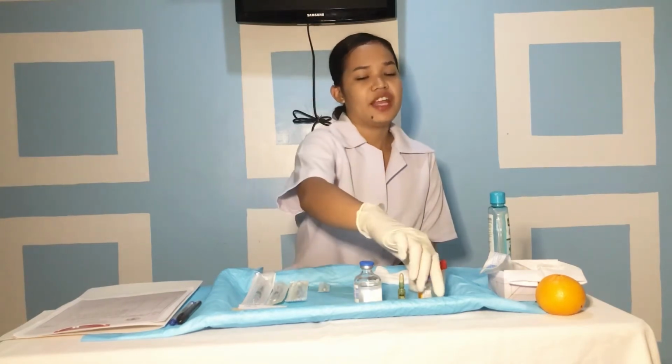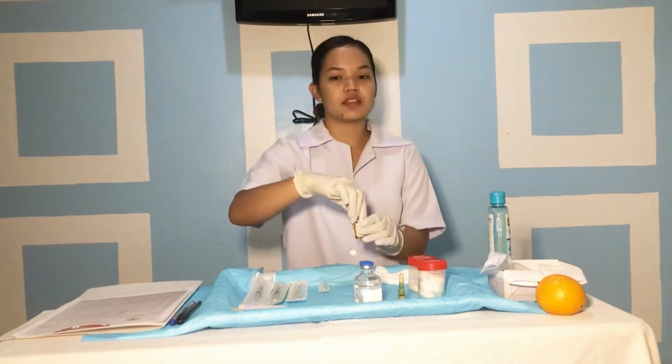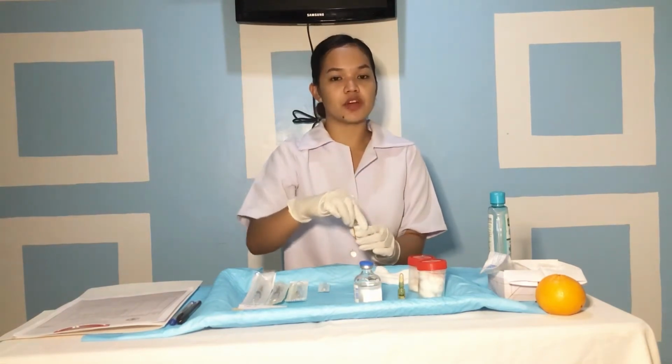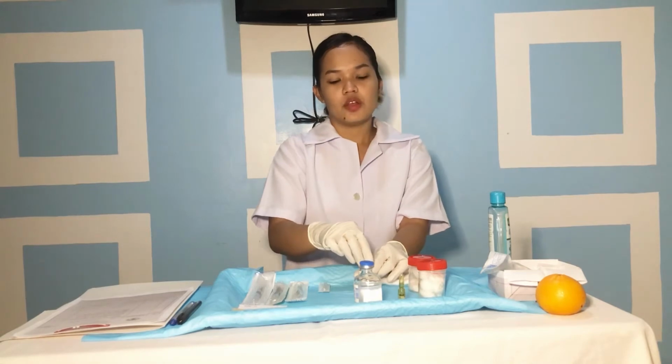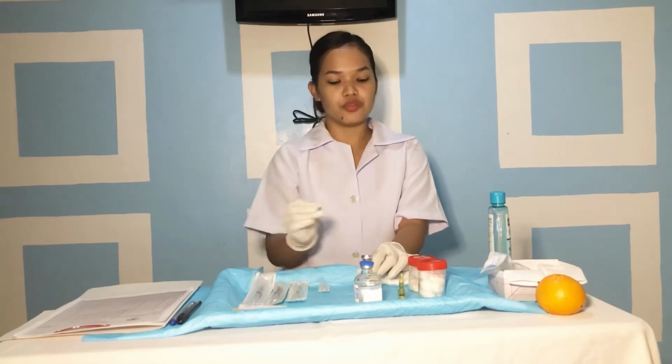First, we remove the cap covering the top of an unused vial to expose a sterile rubber seal, keeping the rubber seal sterile. Since this vial has already been used, the cap is already removed.